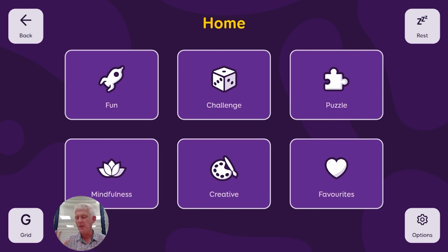With that, I'm going to think about some of the users that we work with. I want to talk a little bit about somebody who is a very experienced eye gaze user. She uses a high cell count communication grid day in, day out, all day long. So she's got good stamina, but she wants something where she can perfect her accuracy and learn her eye gaze skills. She likes something that is strategic, makes her have to think, but also something that is fun and fast and lets her demonstrate and keep her eye gaze skill attuned to fast movement and accurate movement.